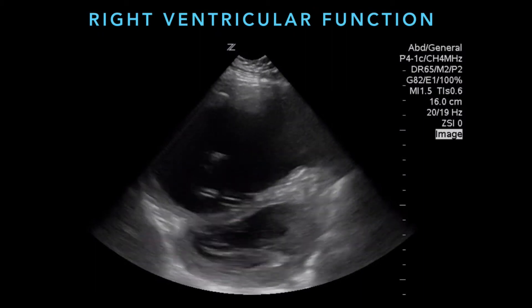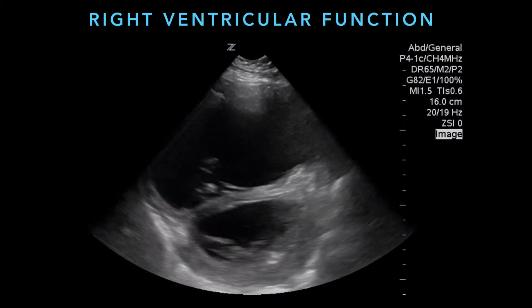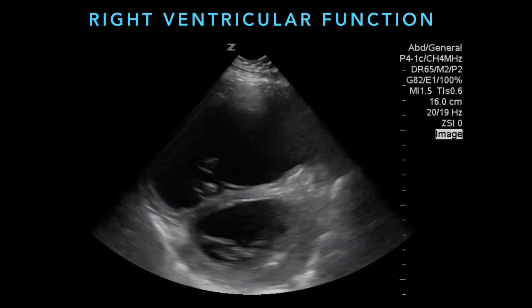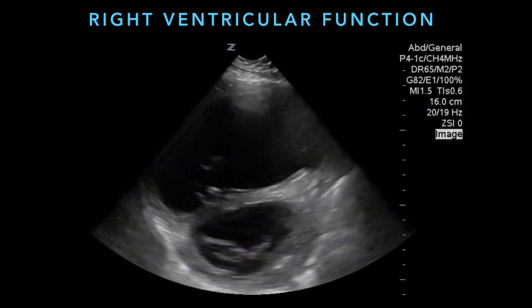Another example: the left ventricle is on the bottom, and you can see how the right ventricle on top is much bigger than the left ventricle. The chamber size is quite different — abnormal — and the pressure in there is quite high because it's moving the septum into the left ventricle.